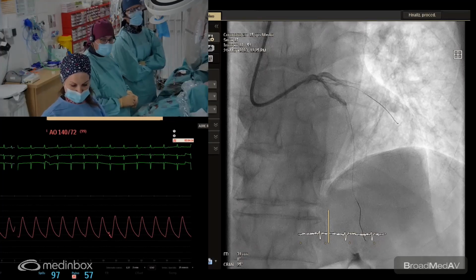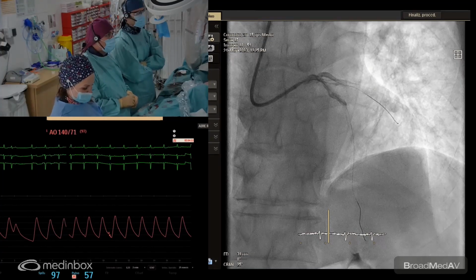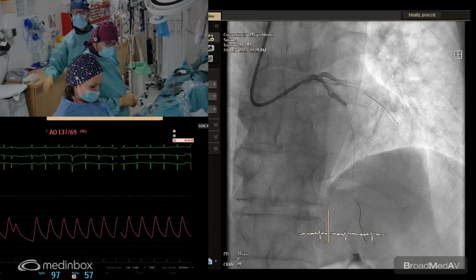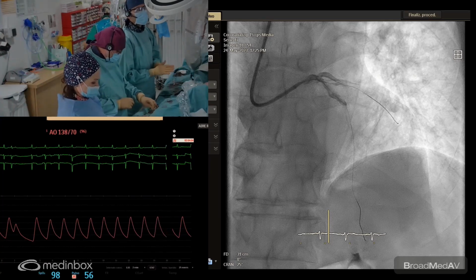3-0, Danny? Yeah, 3-0. Definitely. Probably 3-0 at the distal part and 3-5 in the proximal. Yeah, 3-5 here in the more proximal lesion. 2000 de heparina.